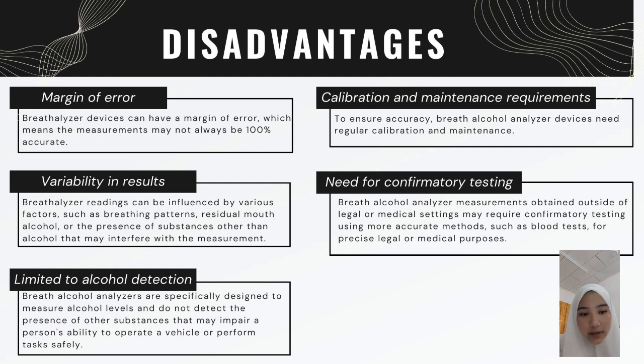The last one is need for confirmatory testing. Breath alcohol analyzer measurements obtained outside of legal or medical settings may require confirmatory testing using more accurate methods, such as blood tests for precise legal or medical purposes.